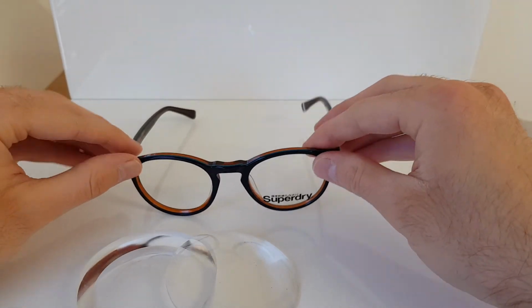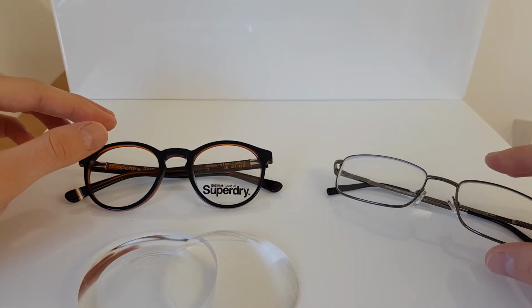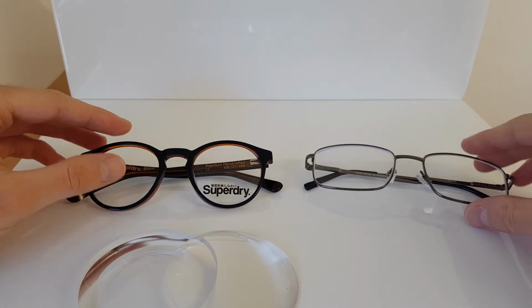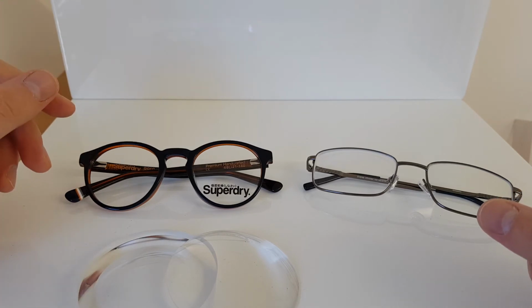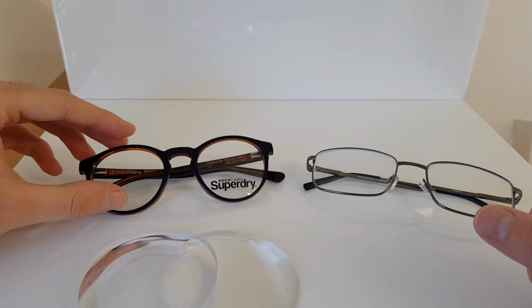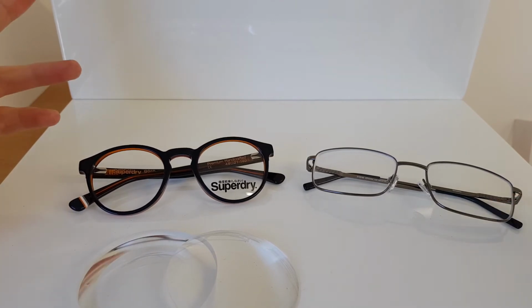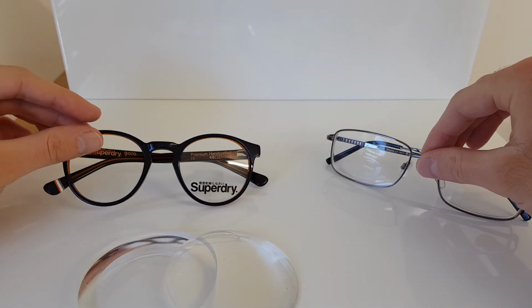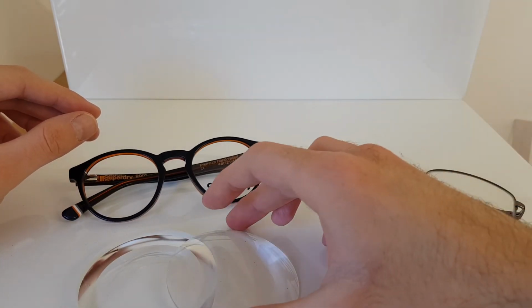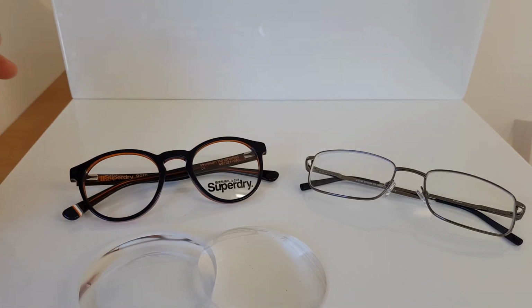So just bear that in mind, a round frame, and look at the type of prescription you've got, whether you need to have something like thinner lenses, whether you're getting them from us or not. If you want to know, would I need thinner lenses or would I recommend thinner lenses, then just pop something in the comments below and just say, look, this is my prescription. Would I need a thinner lens, or what sort of prices would I be looking at? I can give you guys an idea as to how much things should be roughly. Obviously, everywhere's different. But there's my two main things to look at if you've got a thicker prescription.